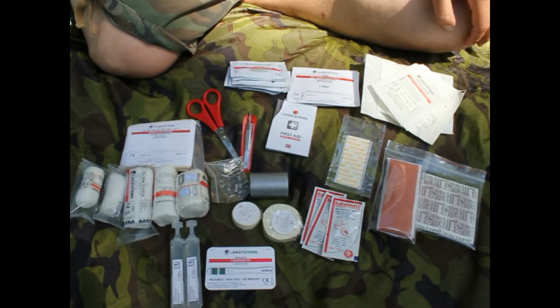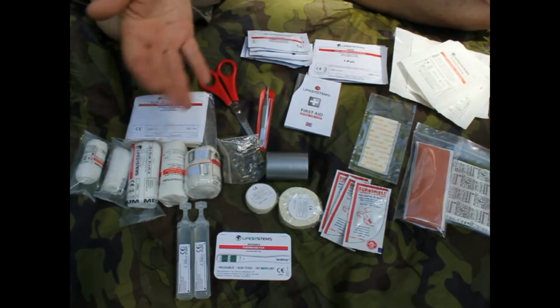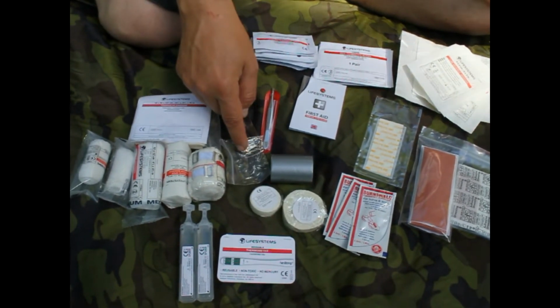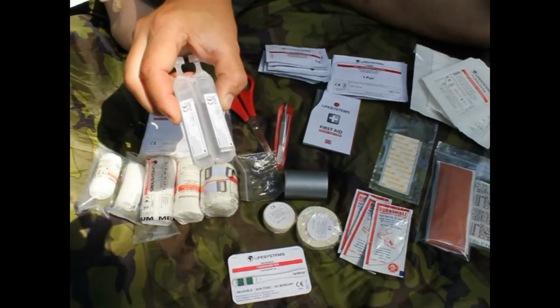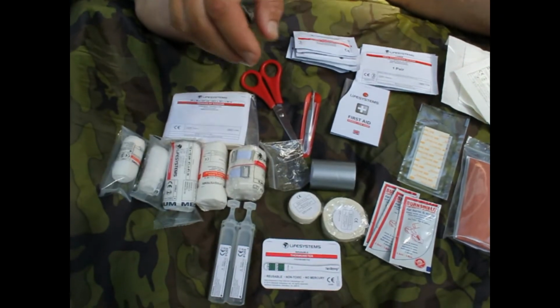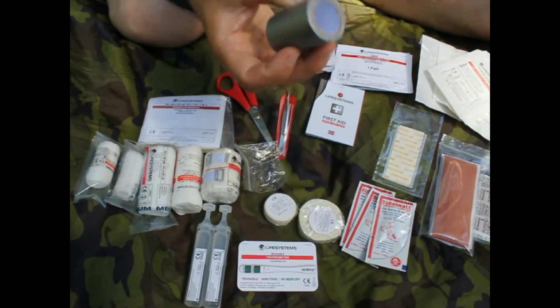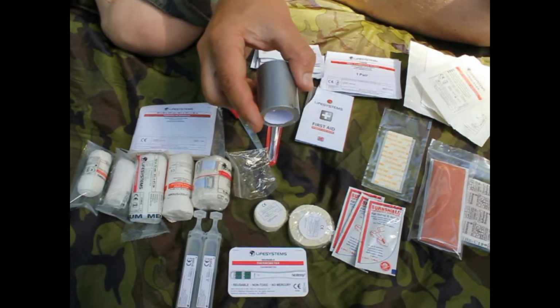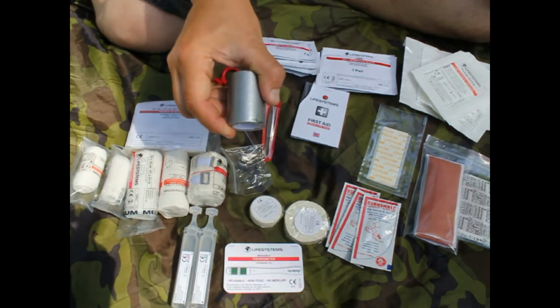For foreign objects, we have tweezers. It's for ticks or splinters or what you need. And we also have needles here and safety pins, and we have this saline solution here, both for eyes and also for cleaning wounds. This is great. Here we have a whole lot of variety of tapes. We have duct tape or gaffer tape, or what you want to call it. These are excellent for sprains or for broken parts, if you need to tape things like that together.